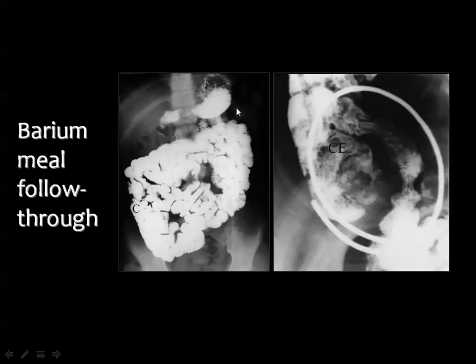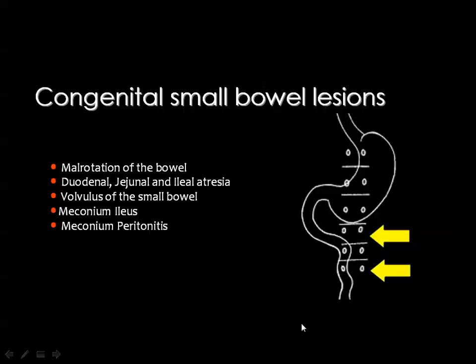Here you can see the barium has reached the colon, but the cecum, which is indicated by this letter C, is masked by overlapping small bowel loops. We have many techniques, including compression and applying some pressure to separate the loops, so that we are able to see the terminal ileum as well as the cecum in a clear image, as you can see here.